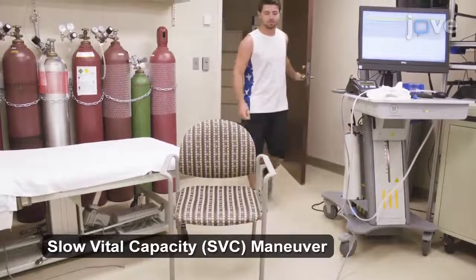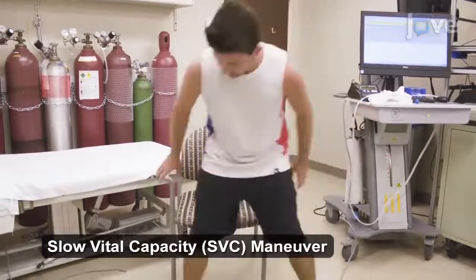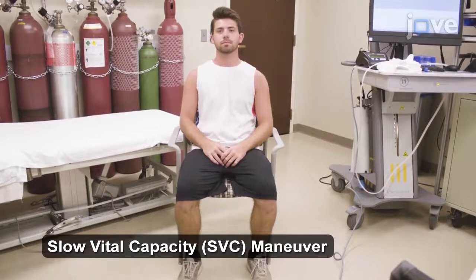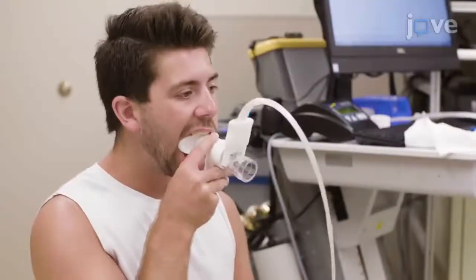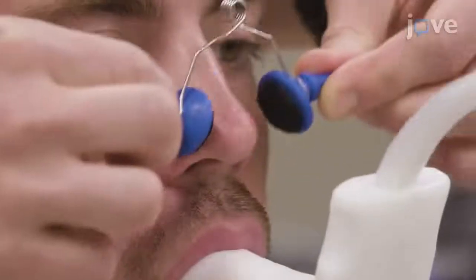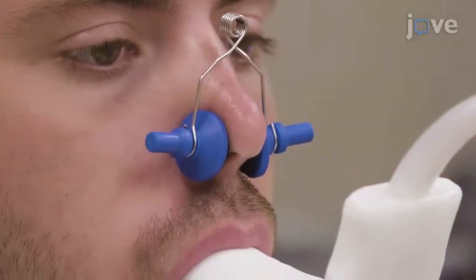Begin the slow vital capacity maneuver by instructing the subject to sit with a straight back and feet flat on the floor with their legs uncrossed. Have the subject put his or her mouth around the mouthpiece and bite down. Then, fit the subject with a nose clip to seal off the nasal cavity.